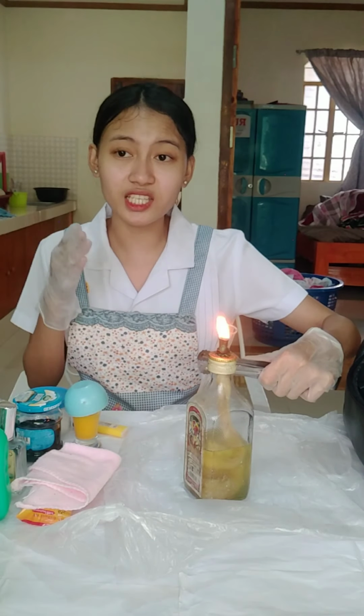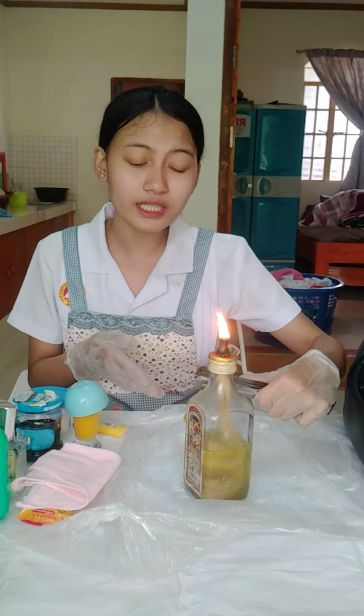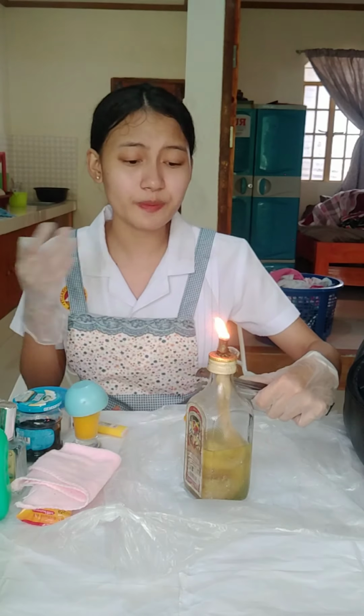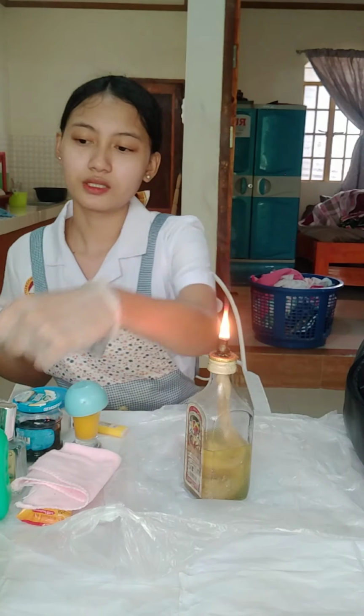So if there is no change, it is negative, which means no turbidity. And then if it is faint turbidity, it is positive 1. If it is moderate turbidity, it is positive 2. If it is heavy turbidity, it is positive 3. And if it is solid, it is positive 4. And then after that, place it on the waste receptacle.